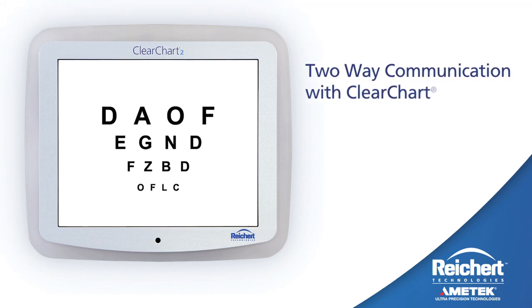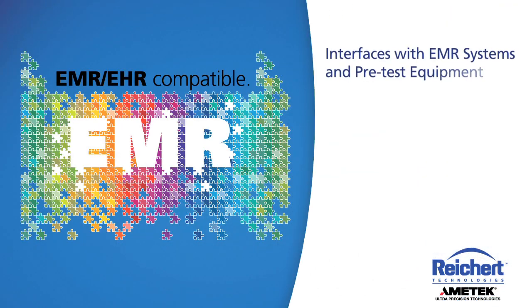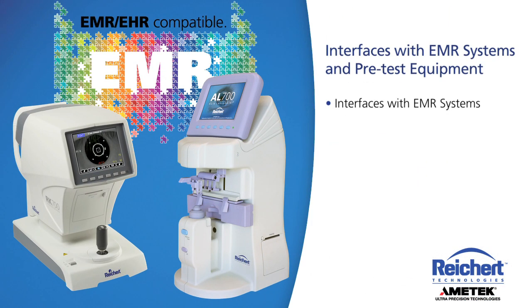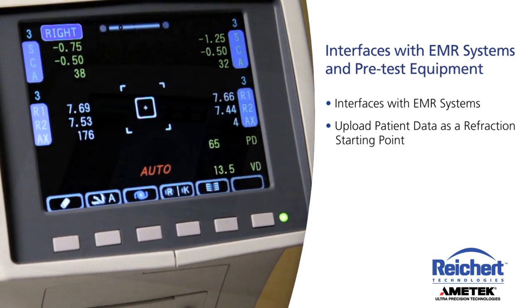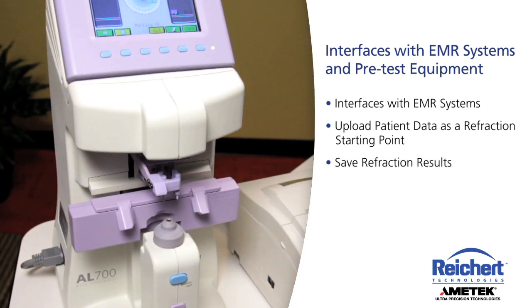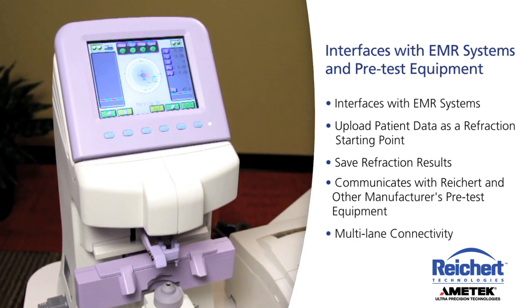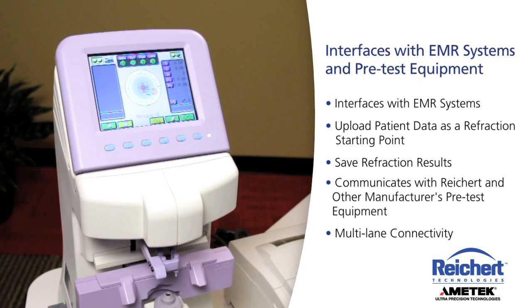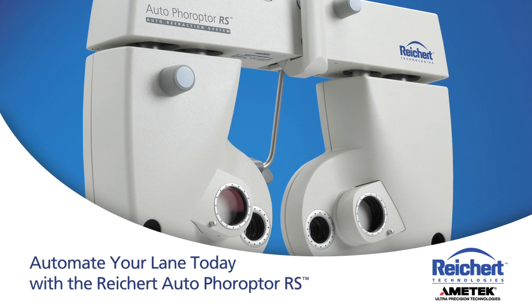The Auto Phoropter RS offers two-way wireless communication with the Rycurt ClearChart 2 digital acuity system for acuity testing during refraction. It can be integrated with EMR systems and can communicate with pretest equipment to upload patient data as a refraction starting point, as well as instantly save refraction results. The Auto Phoropter RS communicates with Rycurt and other manufacturers' pre-test equipment. Connectivity can be achieved with single lane or multiple lane setups. Automate your lane today with the Rycurt Auto Phoropter RS.